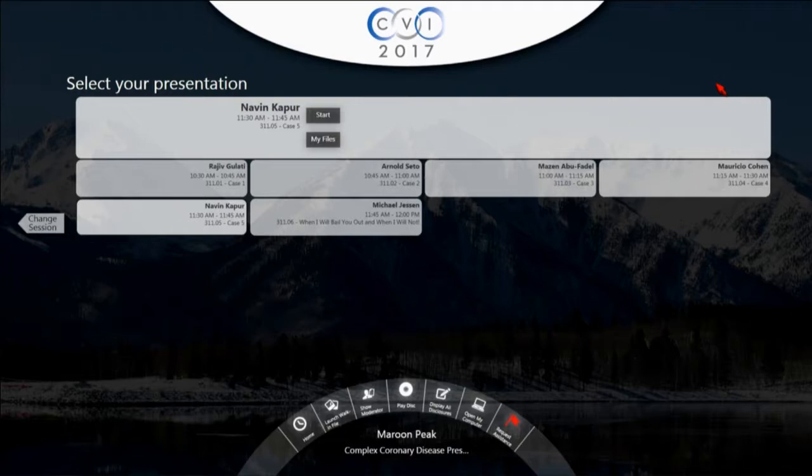Yes. The Impella CP to 5.0 was switched for more support, or you just wanted to switch from femoral to axillary? Yeah, so it's actually a little bit of both. The CP itself is fine, and we've left CPs in for days. The problem is when they're doing a femoral deployment in a guy who we're trying to get to recover, we've got to switch it over to an axillary. And if we're going to do axillary, especially in these patients who are still on that marginal EF and haven't fully recovered at that point, those patients will get a durable 5.0, which allows us to do it through a vascular graft. We've definitely done CP through punctures and through non-surgical graft approaches, and those you can also ambulate. But usually with these types of patients, we like to give them at least potentially up to 2 weeks, 3 weeks of support, and that's where we'll convert over to a 5.0.